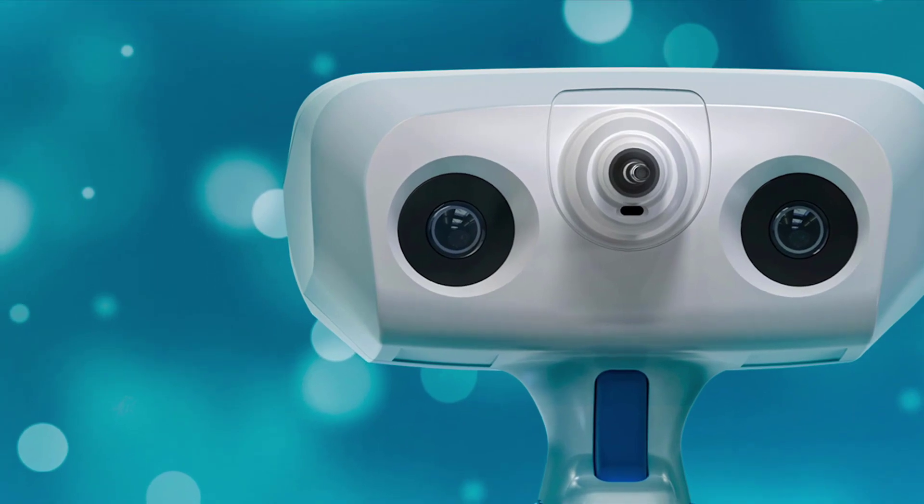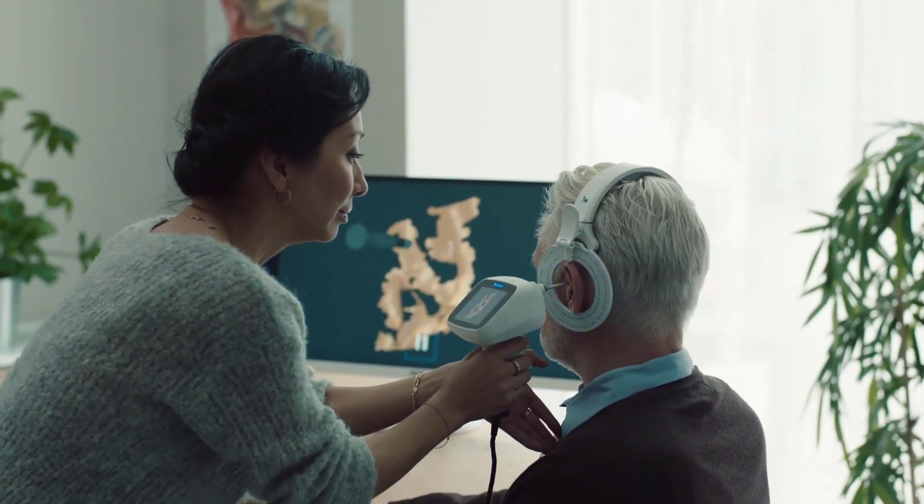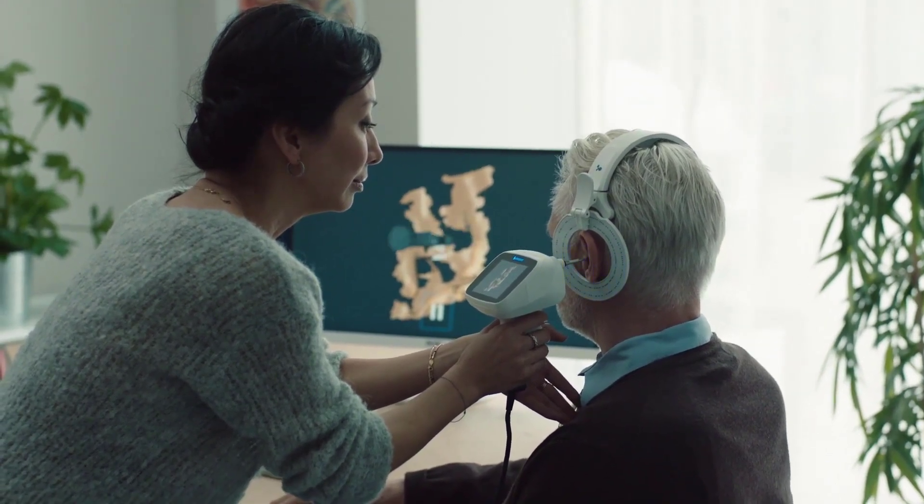This experience that I had early in my career is exactly the reason why I am so extremely cautious when performing a physical ear mold impression, and is exactly the reason why I'm so happy that Natus now has Otoscan. Otoscan is the first 3D ear scanning solution that hearing care professionals can use to make a digital impression of an ear, eliminating the need to use physical impression materials.